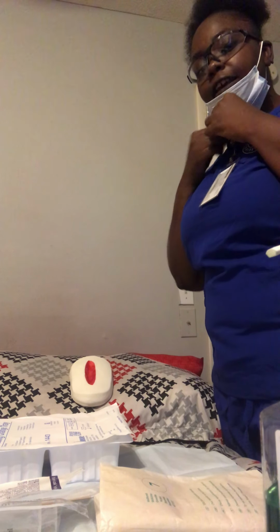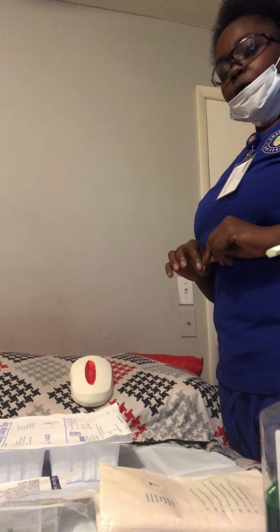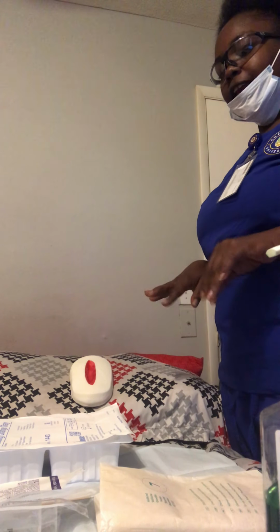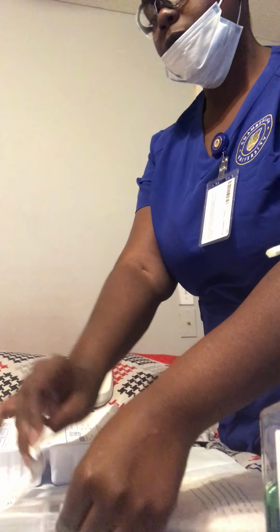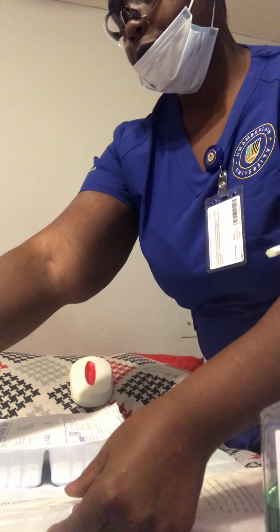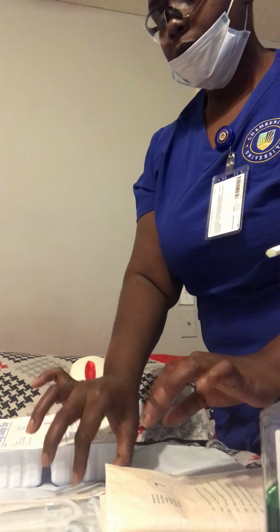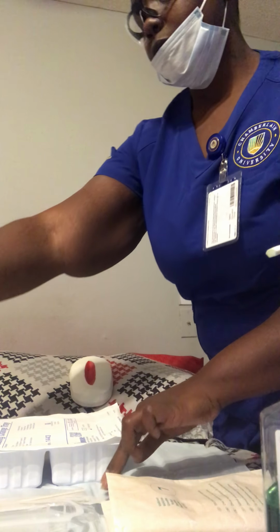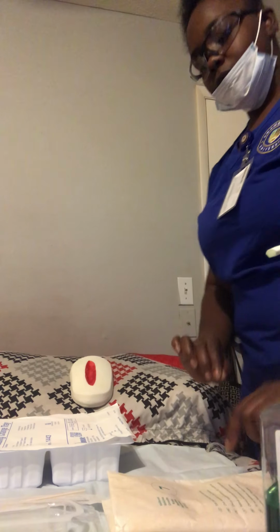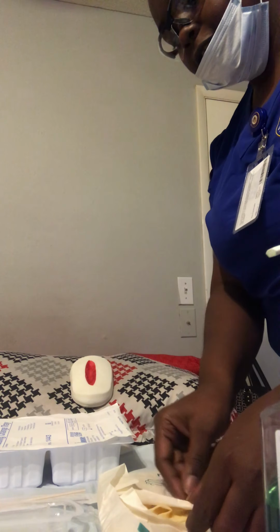And I'm going to leave my mask down so that you guys can hear me. So the next thing I want to do is to get everything ready for my sterile technique. And I'm going to put on my sterile gloves.